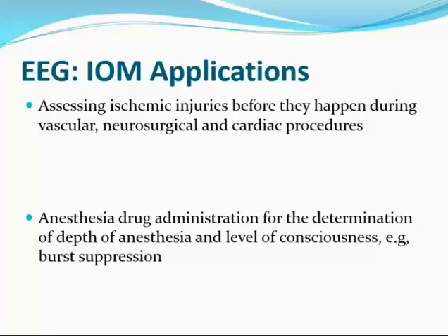When we're looking at the application of EEG during surgery, we are looking at one main thing, actually. As far as we are concerned as neurophysiologists, we are looking at assessing ischemic injuries before they happen during vascular, neurosurgical, and cardiac procedures.